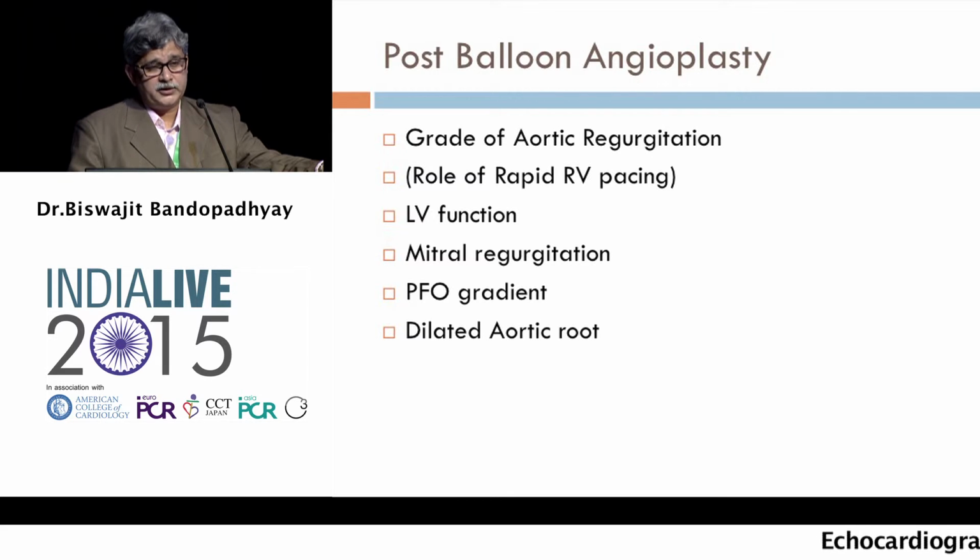Even before we open our gloves after the procedure, we ask someone to look at the echo. There is a grade of aortic regurgitation, which is very important. And if it is beyond moderate, it is not very well tolerated. So you have to be extremely careful.